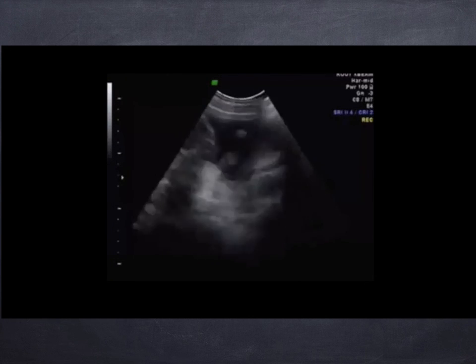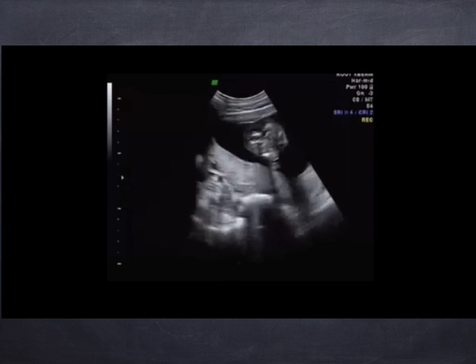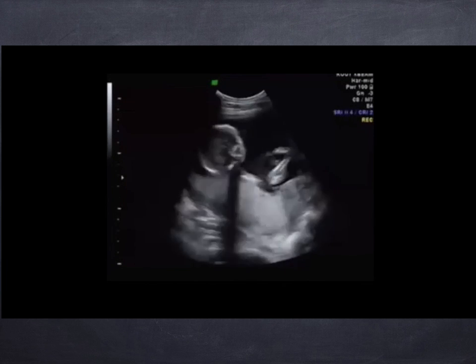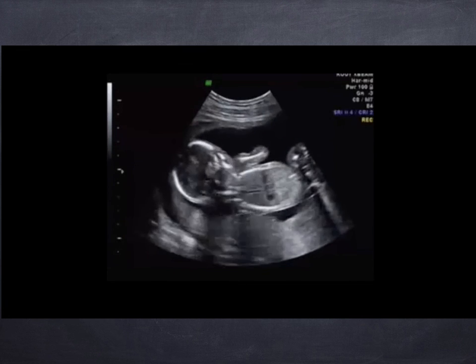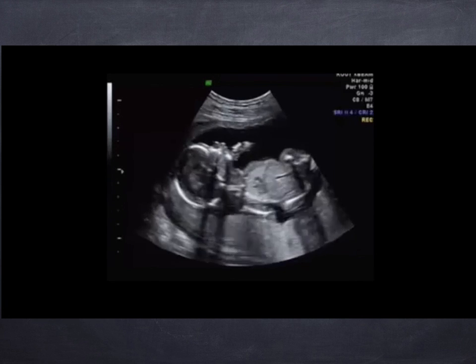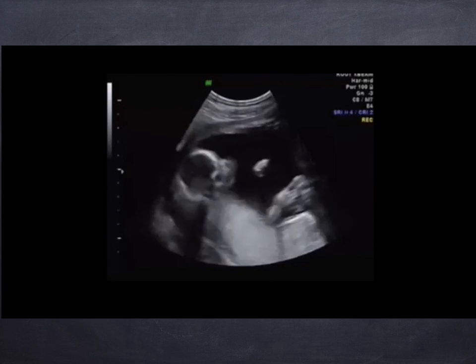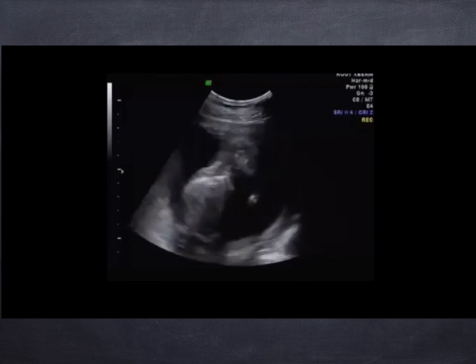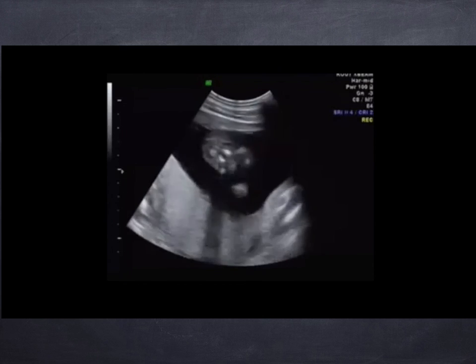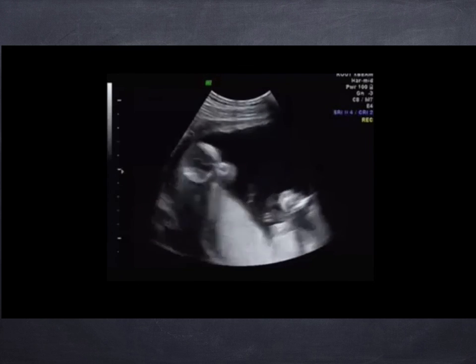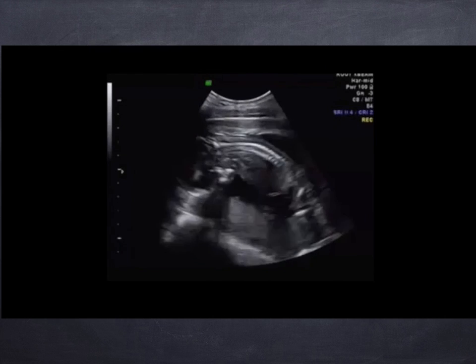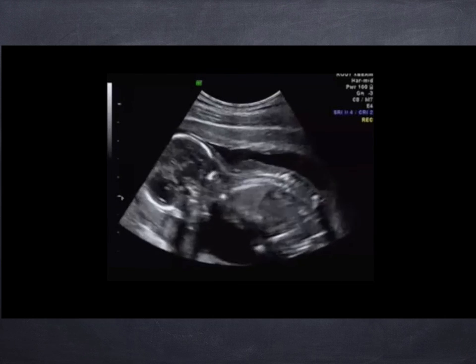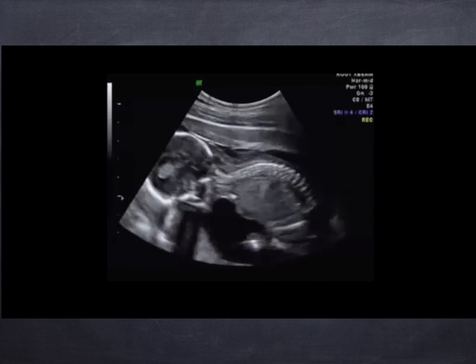Here we see the sonographer trying to determine the fetal position. It looks like this baby is in the breech position. From the window the sonographer is in, the spine appears down. To get the spine in the anterior position with it on top of the screen, swing your transducer to either side of the mother's stomach. Adjust your transducer to bring the sagittal plane into view, revealing the skin line and that nice railroad track sign.